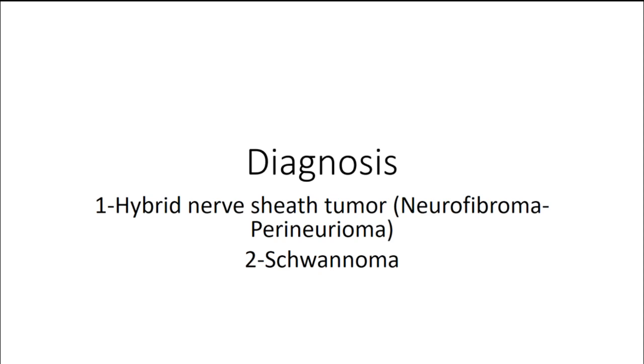So in those cases, sometimes they need these biopsies as part of the diagnostic criteria. So sometimes they can be problematic. So it's important, if you feel that the tumors are of this kind, to do a thorough classification with stains. If you don't have a classic appearance that will tell you this is definitely a schwannoma or a neurofibroma, sometimes being descriptive can do the trick and be helpful. You don't want to overcall something that will lead the patient to go into a different diagnostic clinical category.